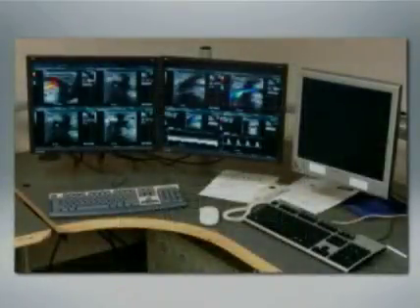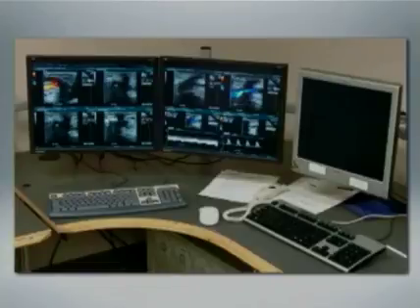Fortunately, by the mid-1990s, many labs were moving into the electronic arena, such as on this early workstation, where we were able to see for the first time both clips and static images brought to us as the sonographer acquired them. And to me, this was a revolution in reading ultrasound. I was able to, as I am now, often have a near complete report by the time the sonographer brought the images to me to discuss.